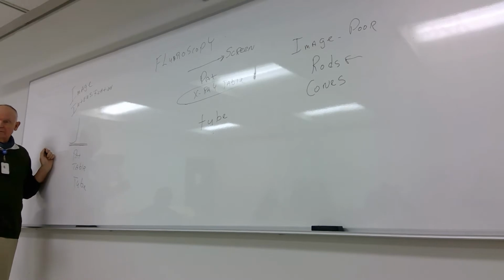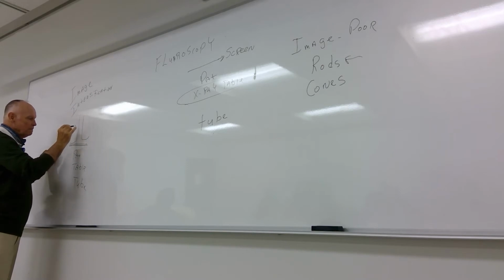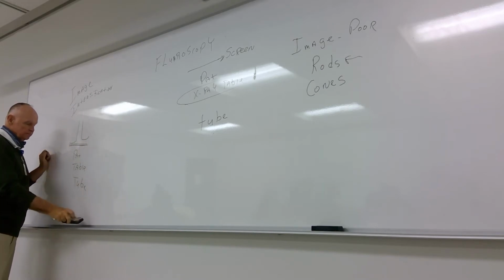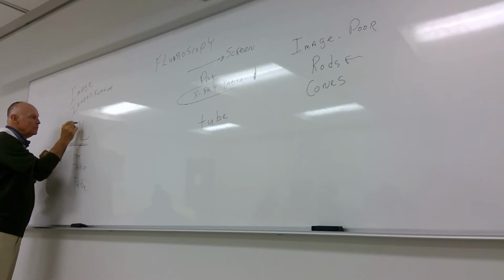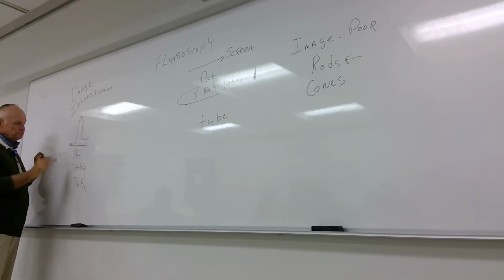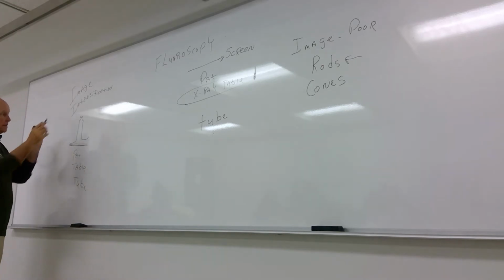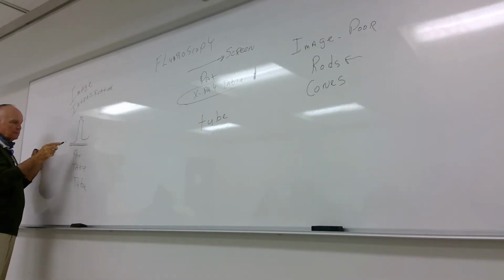It kind of looks like this. And we refer to this as the image intensifier.